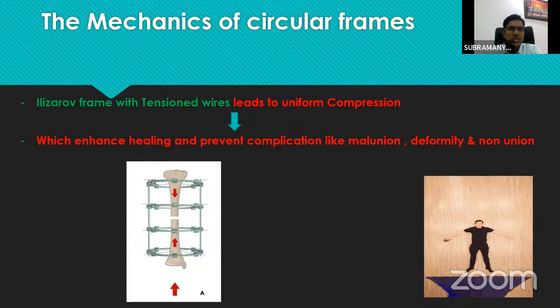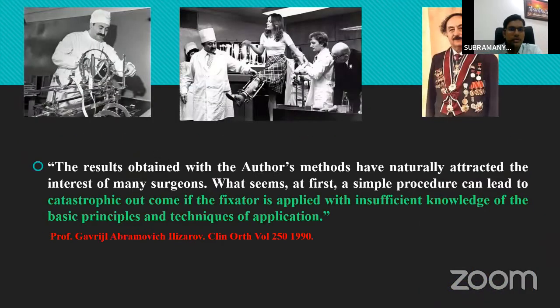So the Ilizarov wires with tension wires lead to uniform compression, which enhances healing and prevents complications like malunion, deformity, and non-union. So I'd like to complete my talk with the words of Professor Ilizarov himself.